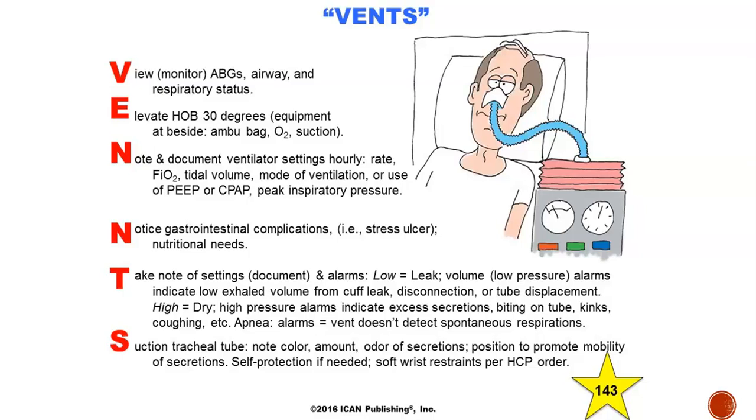Providers, however, are really bad. They're sneaky. They are little Houdinis. So they will go in and change your rate, change your O2, your PEEP, tidal volume, whatever, and walk out of the room and not say a darn thing to you. And then you walk in, and you're like, when the heck did that happen? And you've probably been in your other patient's room or something. So just always keep a note and a check on that, because ultimately it is your responsibility to know what your settings are.